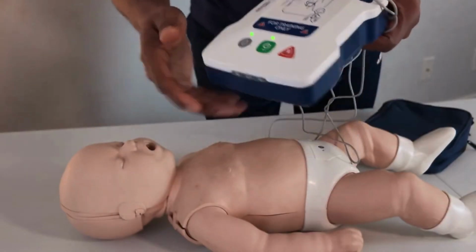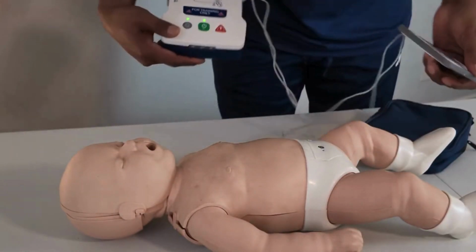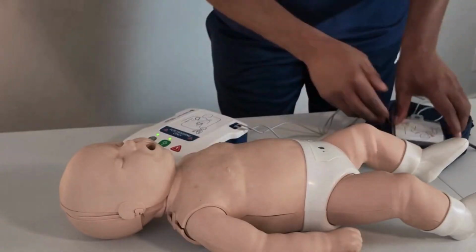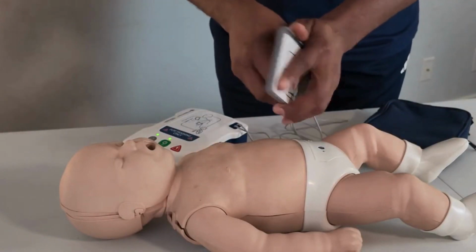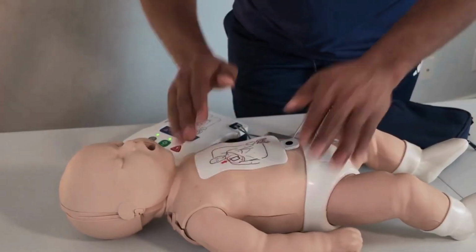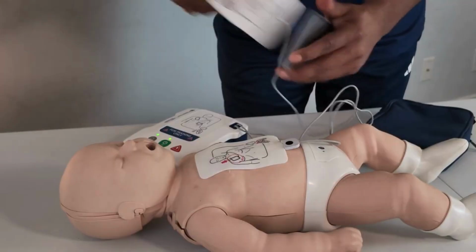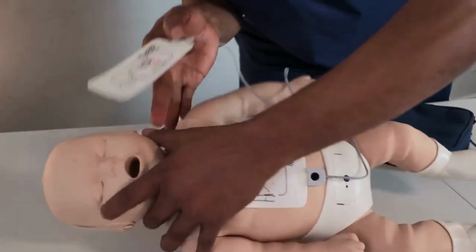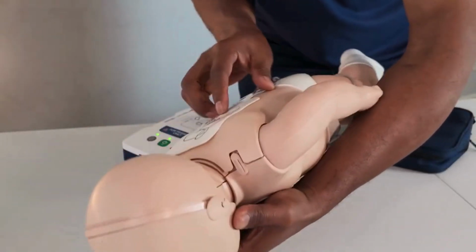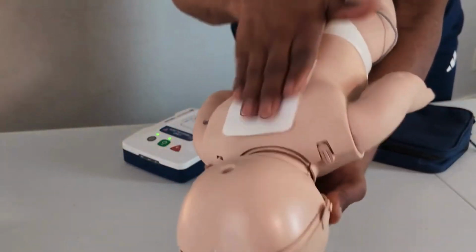Child patient. Remove the child's shirt. So, Remove packet and apply pads onto child's bare skin. Apply pads to child's back and chest as shown in the pictures. Press pads firmly on skin. Press pads firmly on skin.